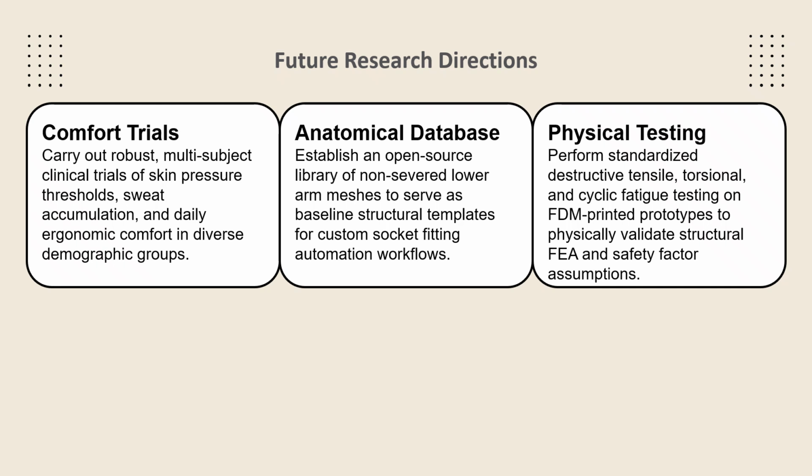The third is standardized physical testing. We will subject physical FDM printed PLA prototypes to destructive tensile, torsional, and cyclic fatigue testing in a physical laboratory setting. This empirical testing will directly validate our finite element simulations and prove our calculated safety factors work under real-world failure conditions.